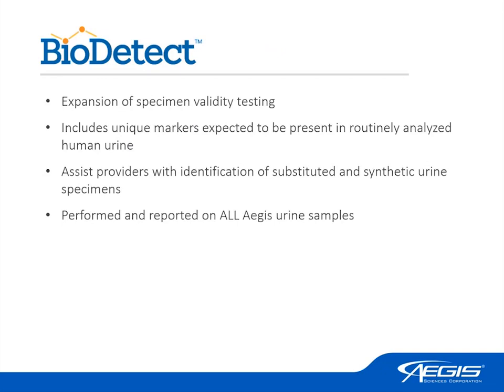And when those markers are not found, we will place on a report a not expected BioDetect result. This will then assist a provider with identification of a substituted or potentially synthetic urine specimen. We do perform and report BioDetect on all Aegis urine samples.